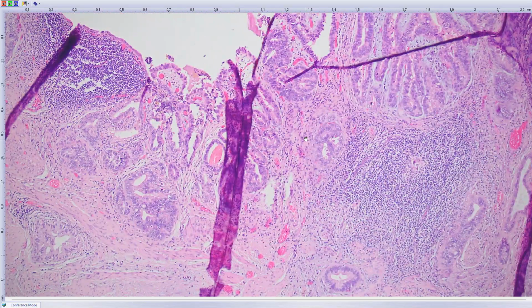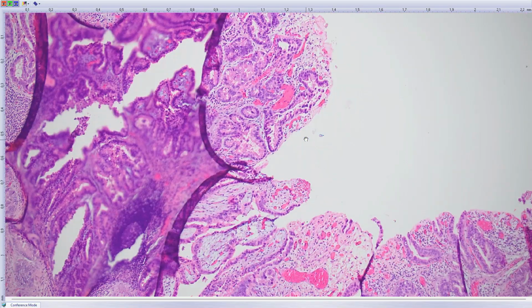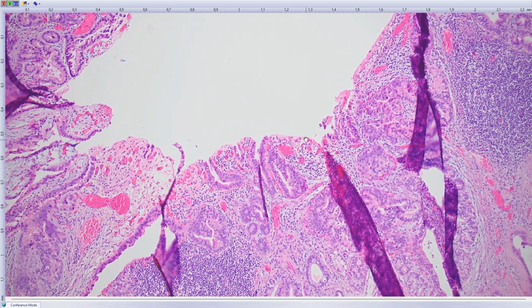So the main thing I wanted to show you is that high-grade dysplasia is what matters in the gallbladder, and it's always an easy diagnosis. It's one second. Okay, if you start thinking reactive or dysplastic, it's probably not dysplasia.